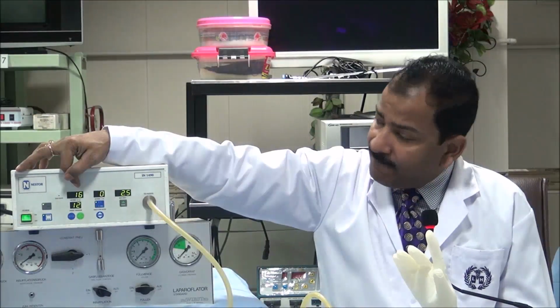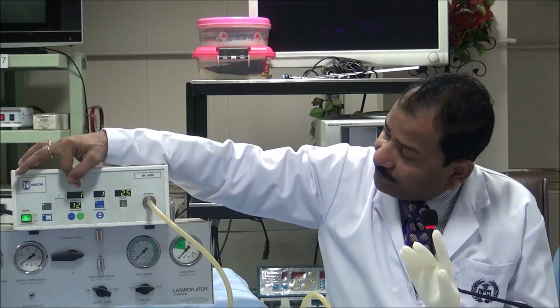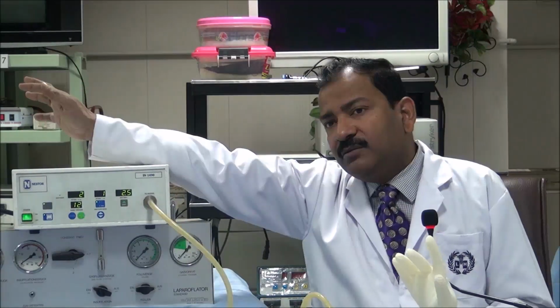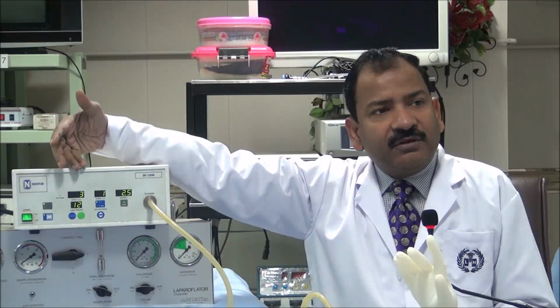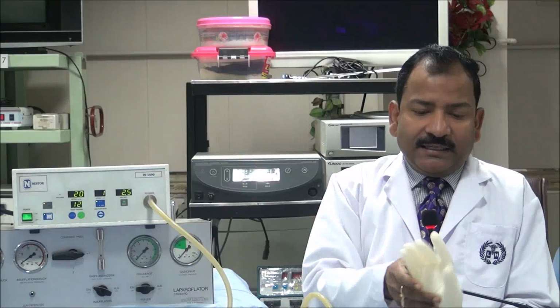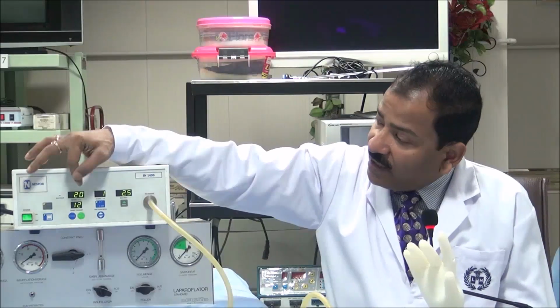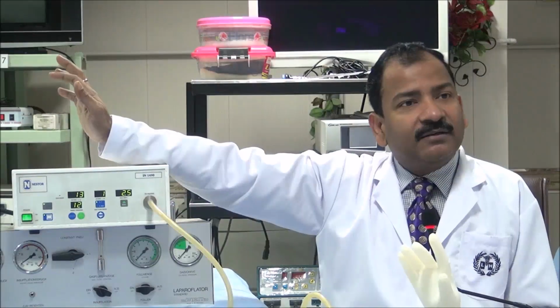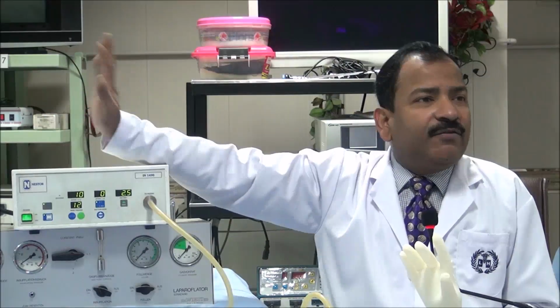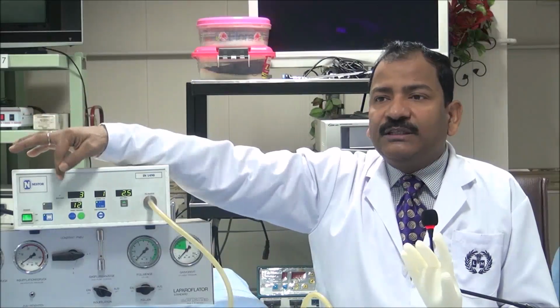Now you will see any time this 0 is not going to come now. It will be 1 or 2 or more. Now 0 is not there. Why? It is little distant. Isn't it? So what is the actual pressure now? 4. You should ignore 24. Don't get panicked with the 24. You should see the minimum. With the cannula mode, this problem is not there.